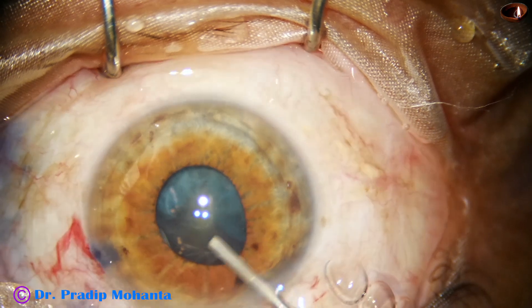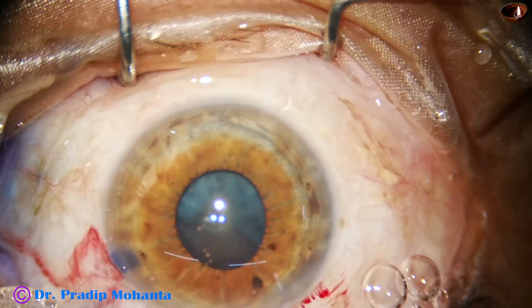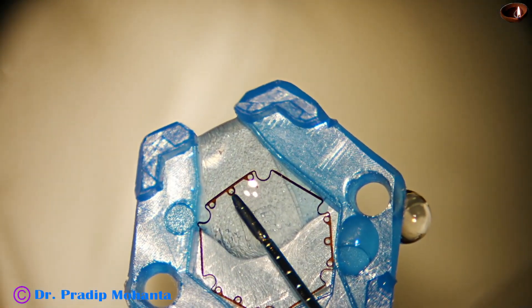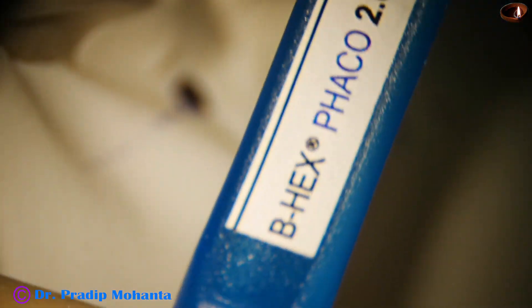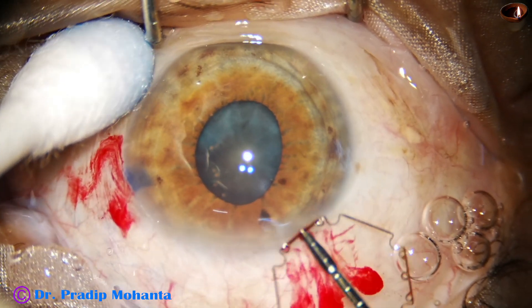Some visco is applied under the iris to create some space so that the flanges of the B-hex pupil expansion device can be easily tucked. This is B-hex FECO 2.0. This gives dilatation of the pupil to about 6.25 millimeters. The pupil takes a beautiful hexagonal shape.